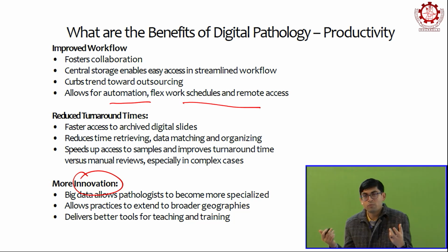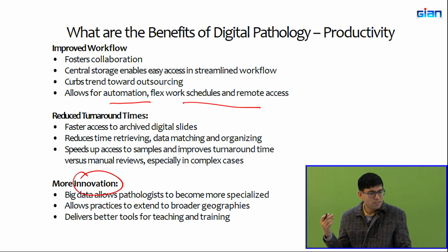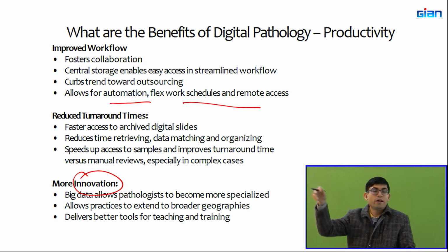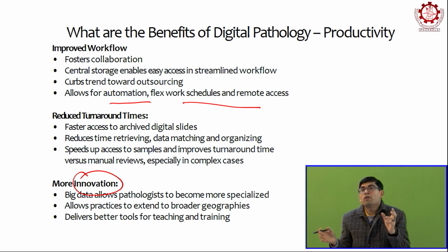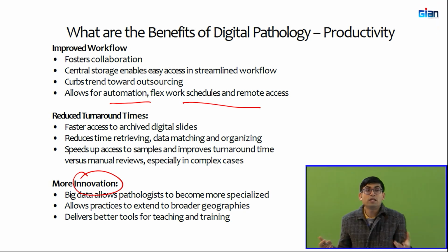This is what happened when I was in +2, and I think they were looking at some seed or something in our botany class, I remember. Now if it was digitized, let's say you take that slide, you digitize it, and now instead of having each student come one after the other and look at the slide, you can actually display that slide, right? You can display that slide, and have everyone look at the same slide. So this is how it can actually help in teaching and training. Even if, for a second, you say that maybe let's not use it for diagnosis, we can still use a traditional method, that's fine, but you can use these techniques for teaching, right?